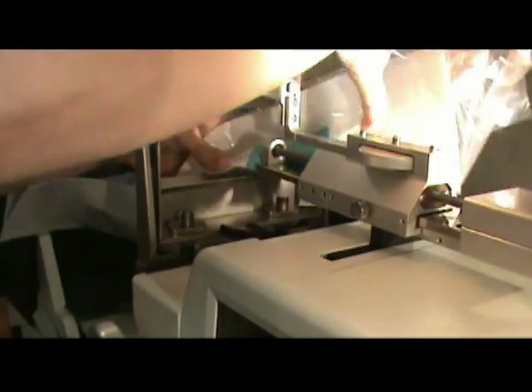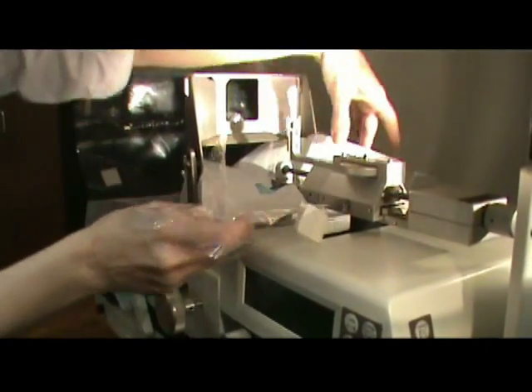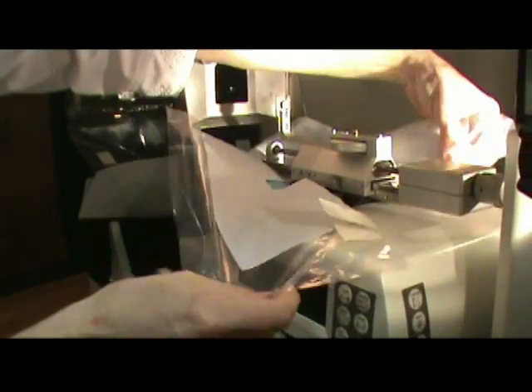Once you're through this area, you can open this back up, and this is going to go around your actual needle guidance system.